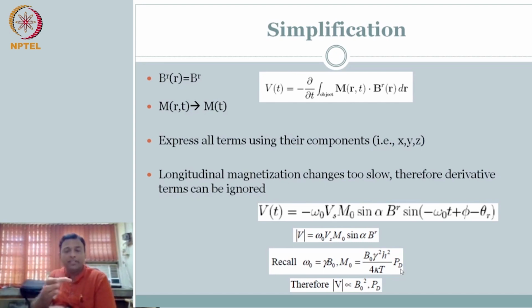Of course, if you are measuring it from a volume, if you increase the volume, right, you get more signal. But you know the challenge. Without talking much, we know the challenge. If I increase the volume, yes, I can increase my signal, but then what is happening? The resolution is going to go down, right? I can say I get this net signal from the head, which is fantastic. I'll have a lot more signal, but then I'm interested in seeing the changes within the brain. So I need some smaller volume so that I can localize better. So this is the inherent trade-off that we'll have, right?